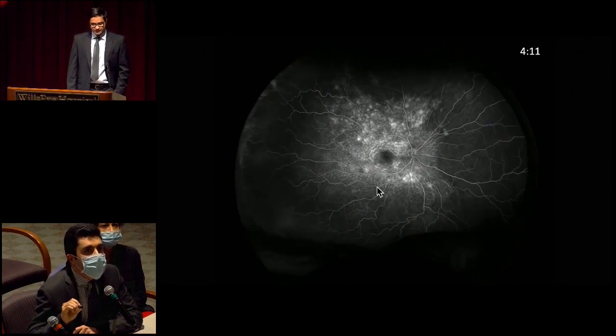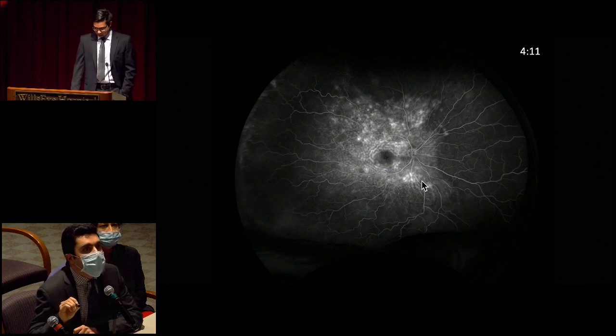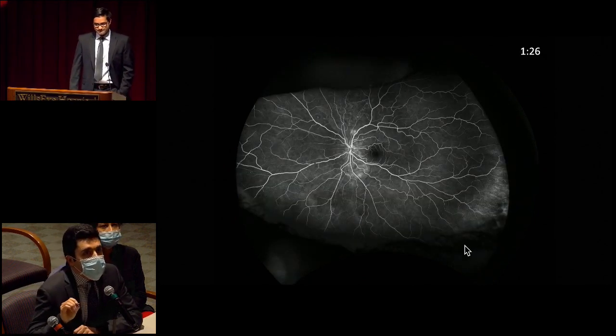Then final frame for the right eye. Similar appearance, similar expansion of these areas. There does seem to be some choroidopathy here. Okay. And the left eye. So 1 minute 26 seconds. Looks like we're past the AV phase at this point.